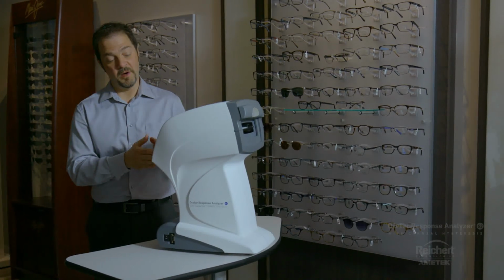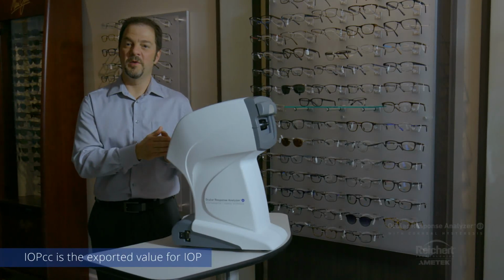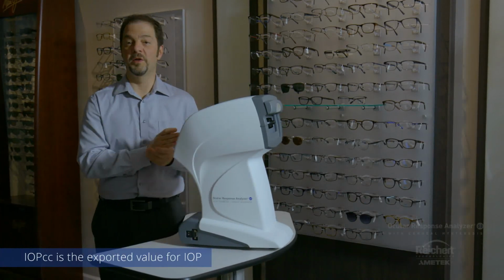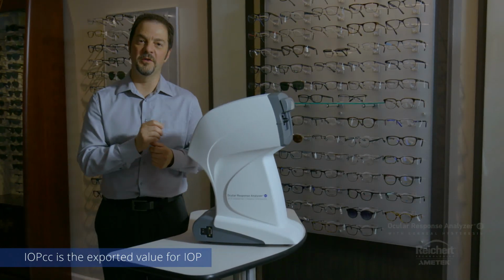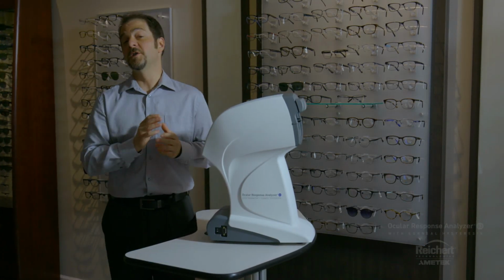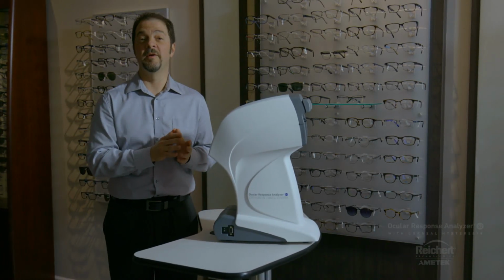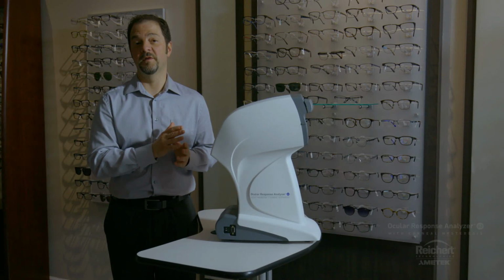The other thing to talk about related to EMR is the IOP measurement. The default IOP measurement that will be exported is our corneal compensated IOP-CC measurement. So if you have an IOP field in your EMR software, that's the value that will populate that field. Some EMR softwares have corneal thickness based IOP adjustment algorithms built into them.